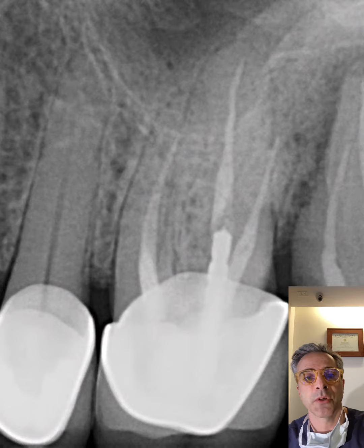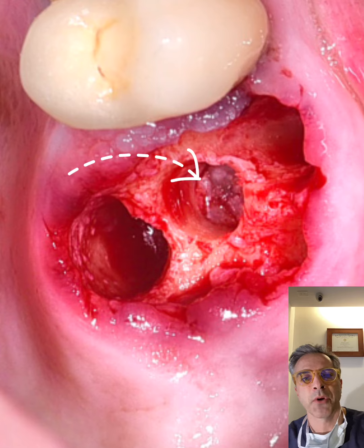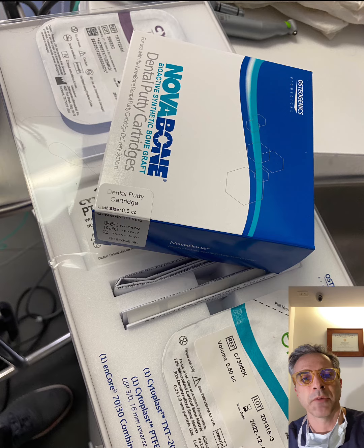I went ahead until I saw the sinus membrane with those burrs. The Nova bone was introduced and I was able to lift up the membrane five to six millimeters.